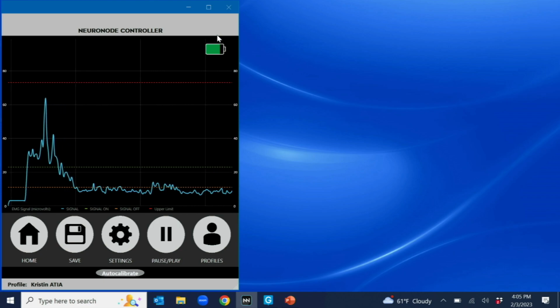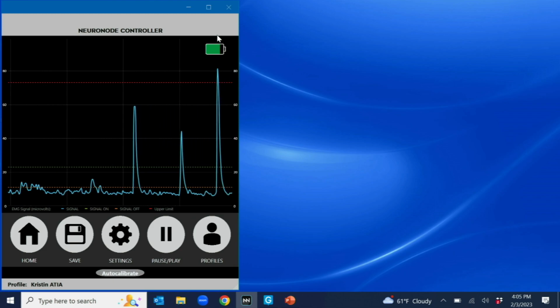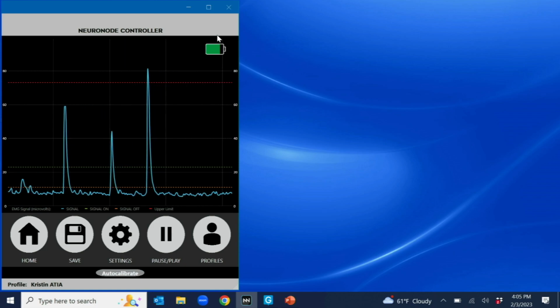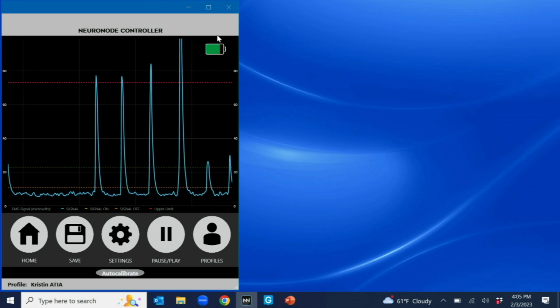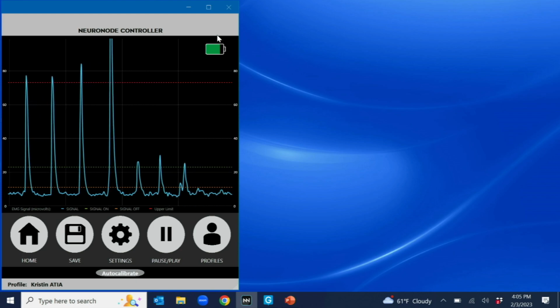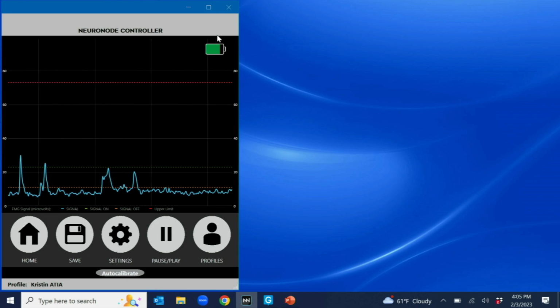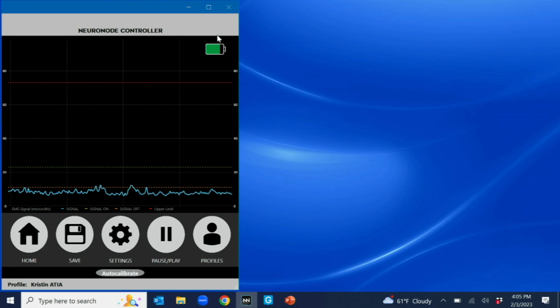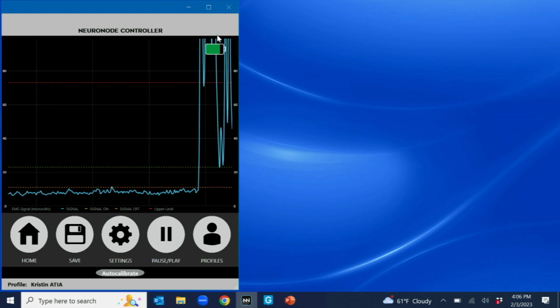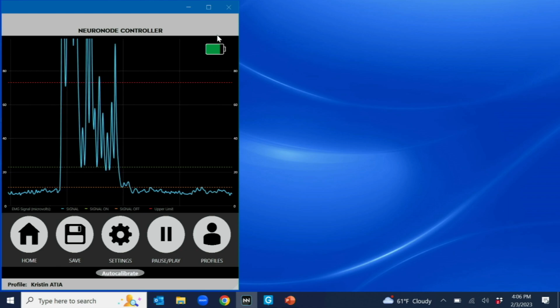And we're going to talk a little bit about this concept of an upper limit switch. So historically with the NeuroNode, you can see that blue line on the screen. That is showing me the movement or the electrical activity associated with the movement. So if I make a small movement, as long as I get above the green and then come back below the amber, it considers that a switch. But what happens if we have someone maybe who has some tremors, maybe some seizure activity, and uncontrollably they make a huge movement? Do I want that to count as a switch and then start the scanning and pick something that I don't want? Probably not.